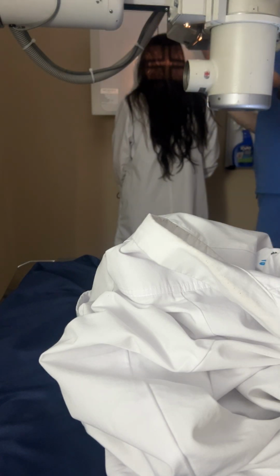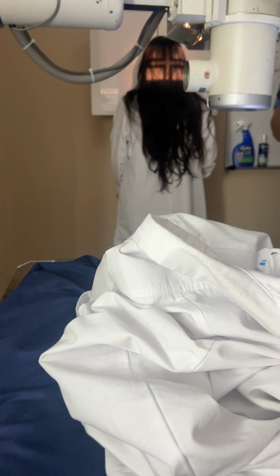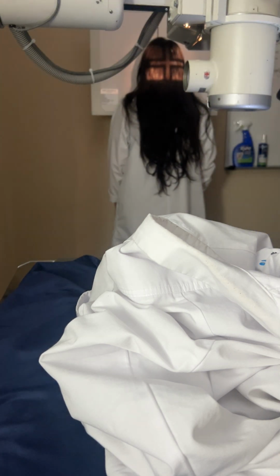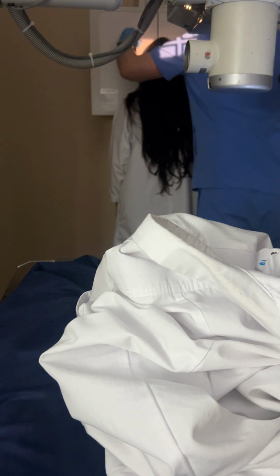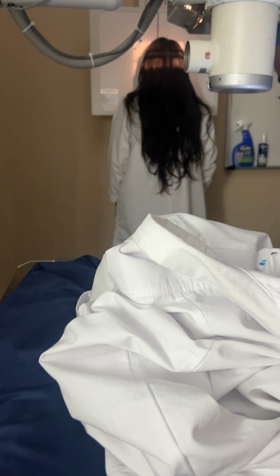We are going to get her mentomeatal line perpendicular to the board. Mentum is here, meatal, so we're going to tilt her head all the way back, just like that, which means that her OML is going to form a 37-degree angle with our IR, okay? Our CR is exiting what level? The acanthion, yes. What is that at? Right here, okay?